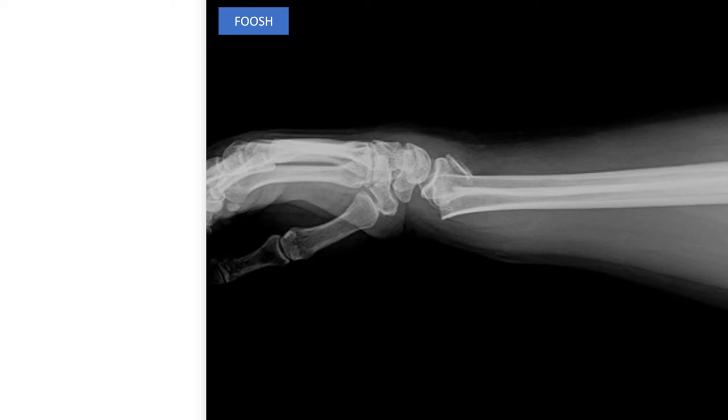Okay, so let's go through a distal radius reduction here. This is a patient who has fallen on outstretched hands and gotten a distal radius fracture with a dorsally angulated segment. That might be called a Colles fracture, but it's getting out of fashion. This is the dorsal side, this is the volar side, and then we need to consider, should this be operated on or reduced? I don't want to go into all the details of distal radius fractures and when to operate or not right now. This is just an example of reduction.